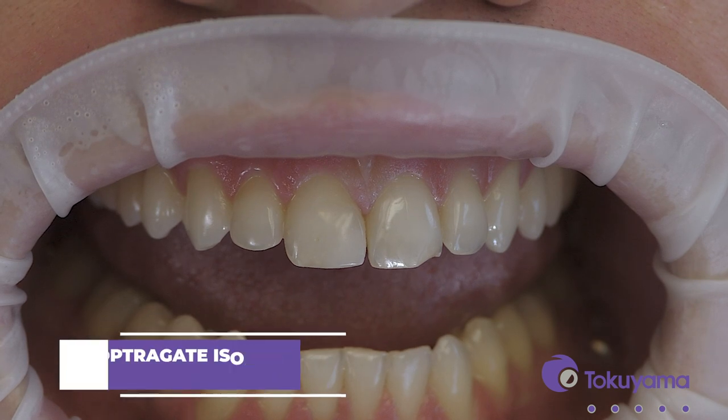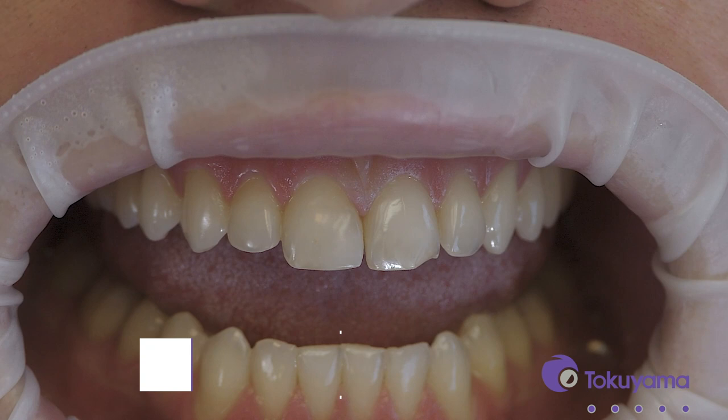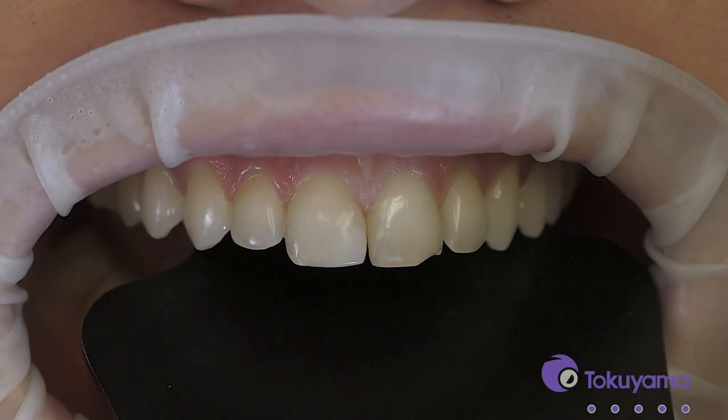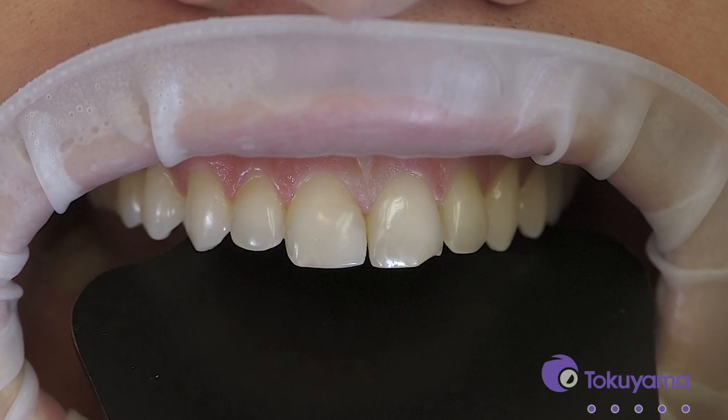So for Mason's tooth here, number nine, you can see he chipped the distal incisal edge. In a situation like this where the tip of a front tooth breaks, when we use a traditional composite system, we either have to use a bunch of different colors to try and get it to work, or if we use a single shade, initially it might look okay, but then as time goes on it changes because the tooth is going to change but the composite stays the same, so you get that color difference.